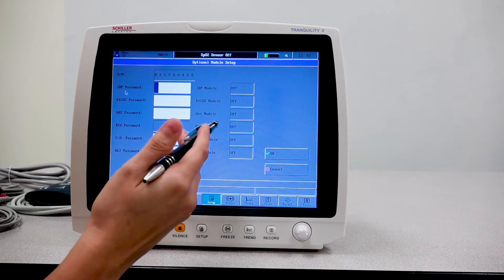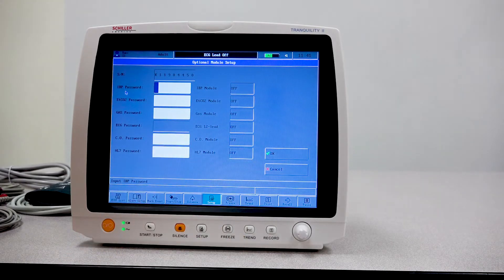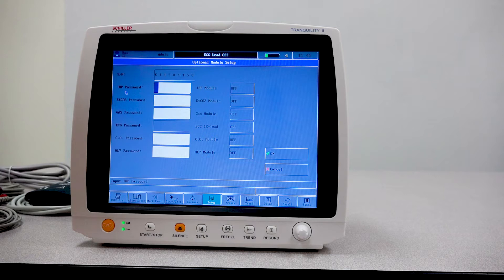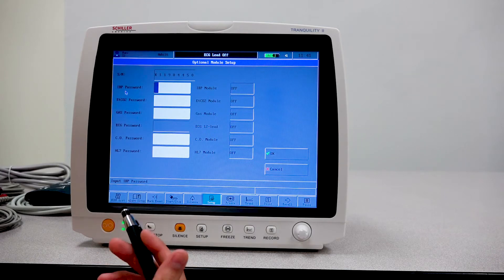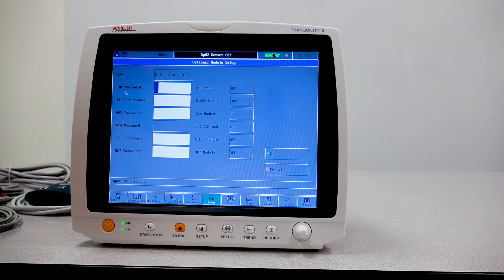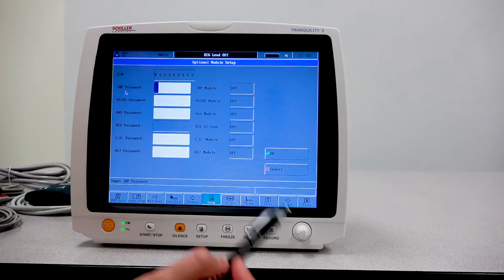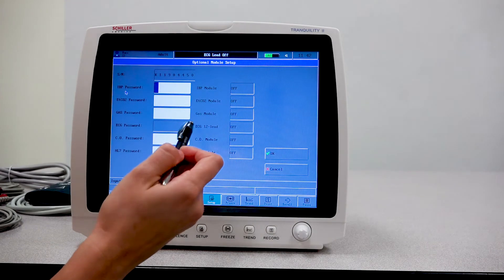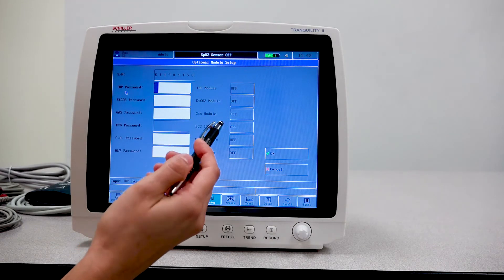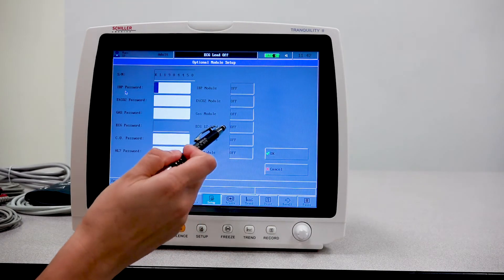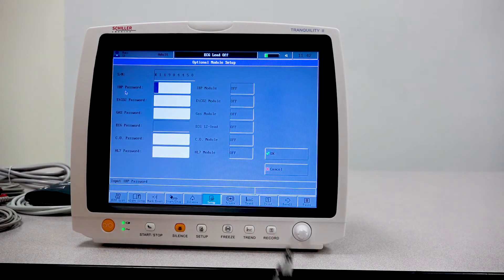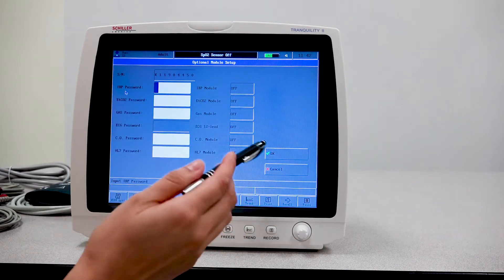One thing that I wanted to point out that is kind of important: this unit is actually capable of doing up to a 12 lead patient cable. But in order to have this available, this needs to be ordered with this option. If you try to change it after you have received your unit, that's not going to be available. You only have the ability to select the three or the five lead. So if you do want 12 lead ECG abilities, just be sure to let that be known prior to ordering the unit.